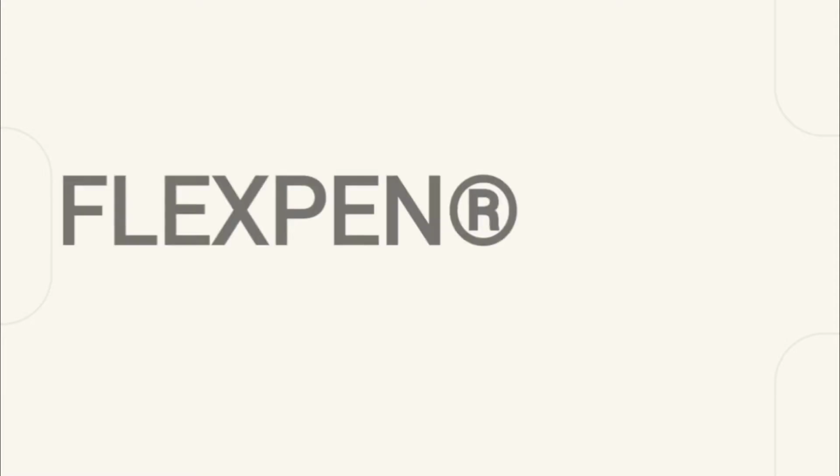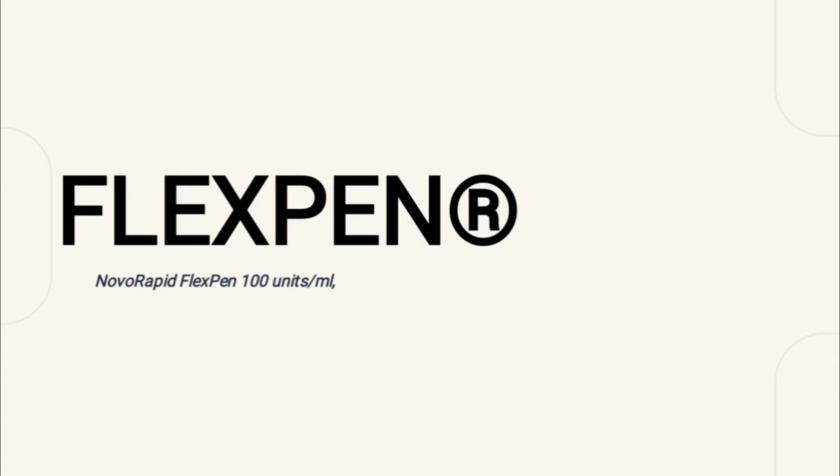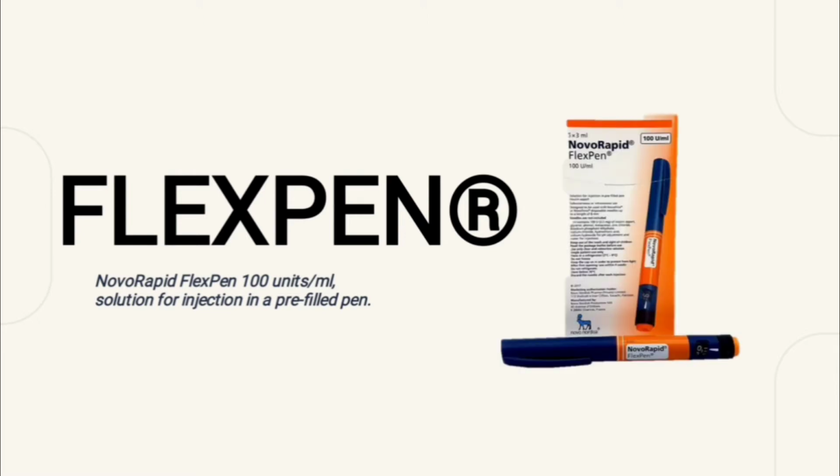So number 1, Flexpen or Novo Rapid Flexpen. 100 units. It has 100 units per ml. It is a solution for injection in a pre-filled pen. It is also used for insulin injection. It looks like a highlighter or a pen. That is why it is called Flexpen.